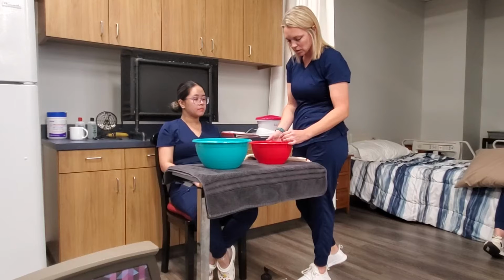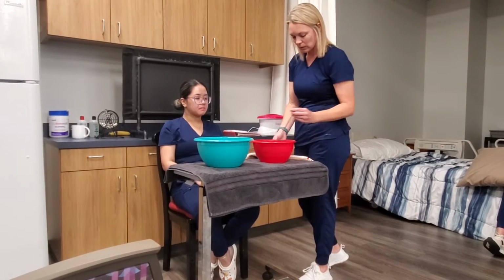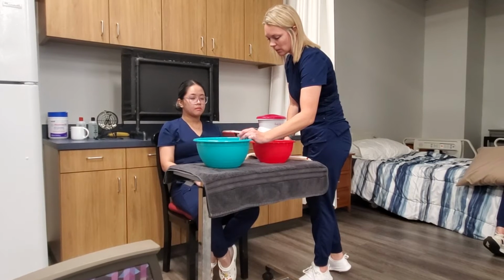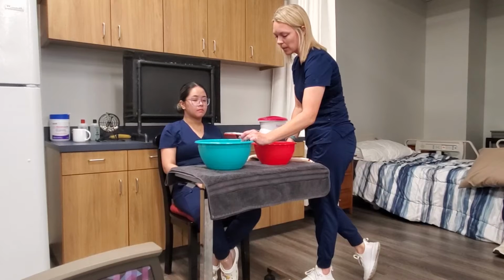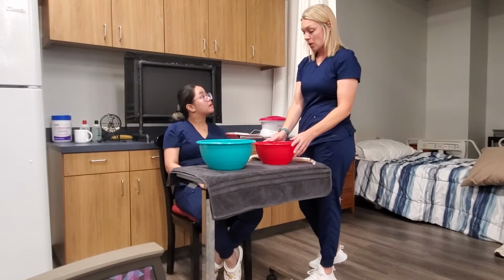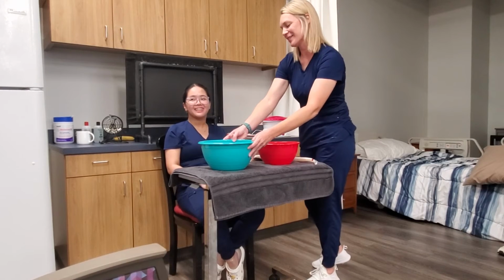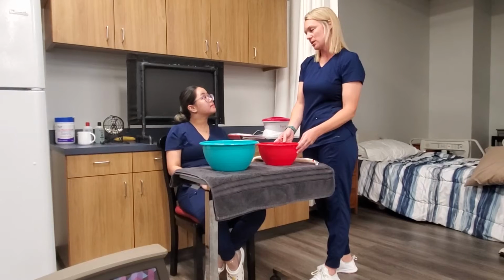I wanna make sure it's not too warm. Okay, we're good there. This one is gonna feel a little bit cooler, especially coming from the hot, but hopefully it'll really help with that pain. So what are the temperatures of these baths? So the hot, we want at 98 to 105. Okay. And this one is going to be 58 to 69. Okay. So it's gonna feel different.